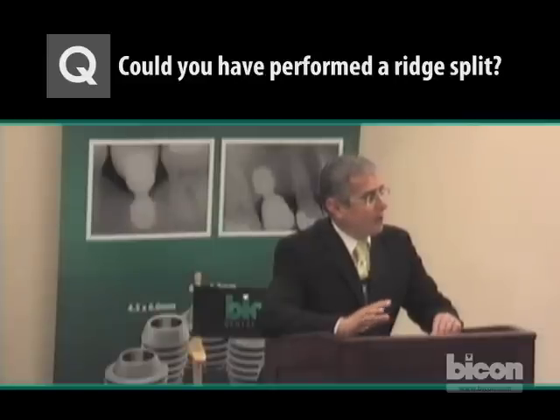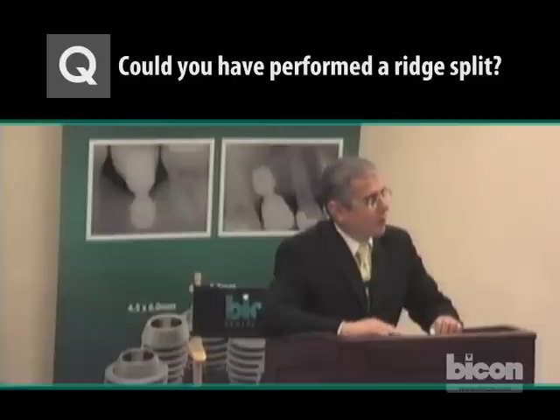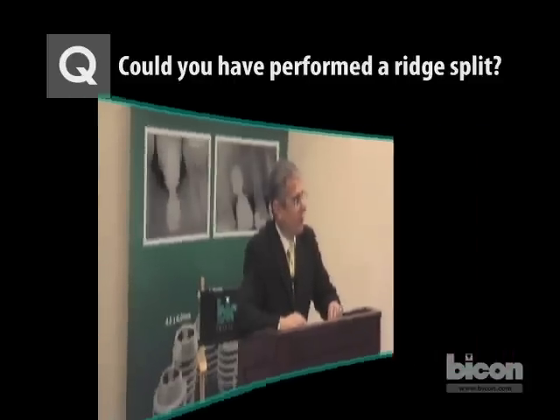This approach allowed us a chance to preserve the papillae. A ridge split technique in the aesthetic zone undermines the interdental papillae. So in this case, it was a better choice for the safety of the sinus and the protection of the dental papillae.